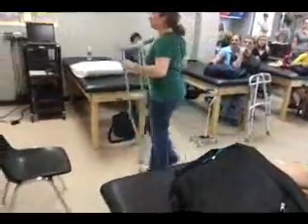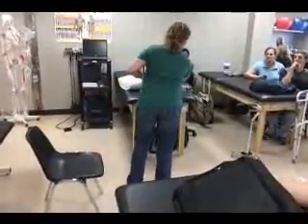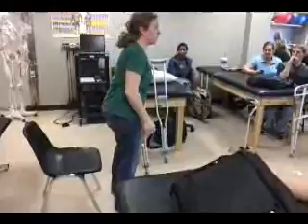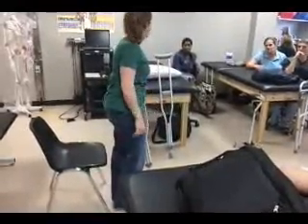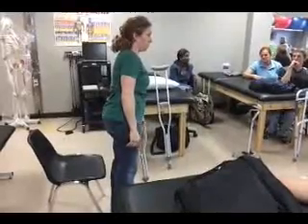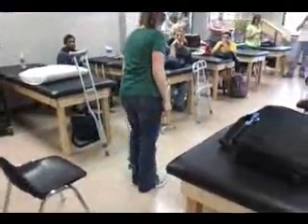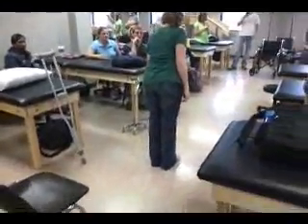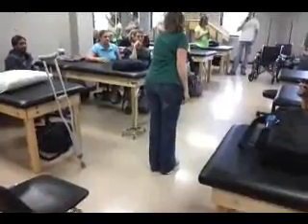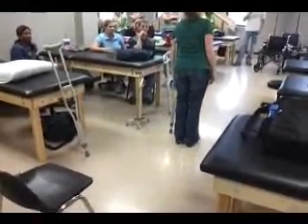Let's say I'm a person who had been using 2 crutches and I'm full weight bearing, but I'm still kind of weak, maybe because I had an old injury, and I'm ready to move down to just 1 crutch. What would this pattern be called? 4-point modified. It's a modified 4-point. Why? My crutch is advancing by itself, then the bad foot, then my good foot.